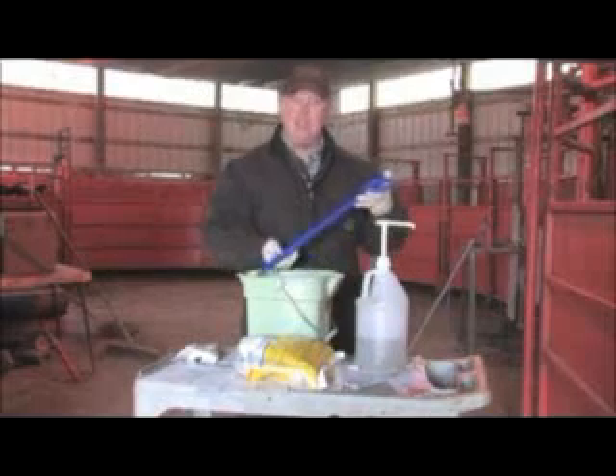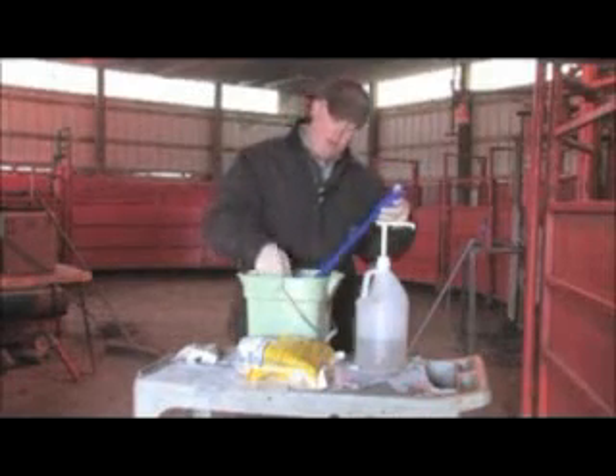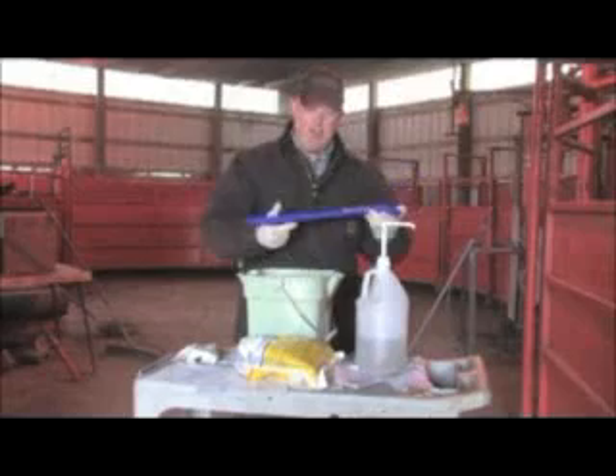Between each animal, it is important to clean the CIDR application gun. To do so, use the water that contains the mild disinfectant, trying to ensure that all fecal material is removed off the CIDR applicator. This minimizes the chance of spreading disease from animal to animal.